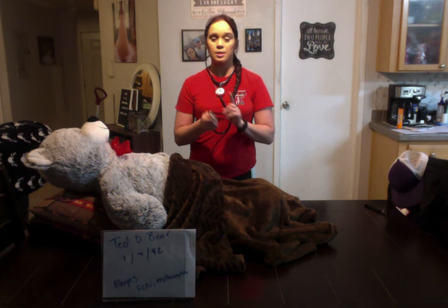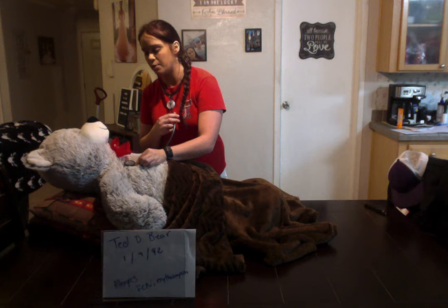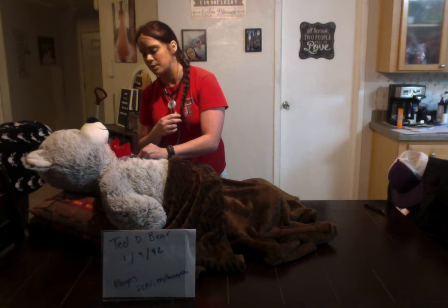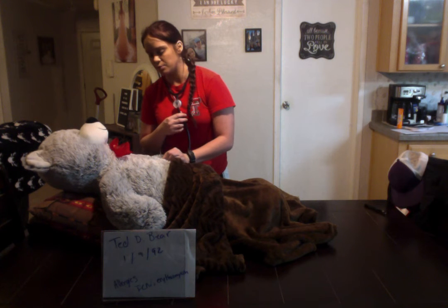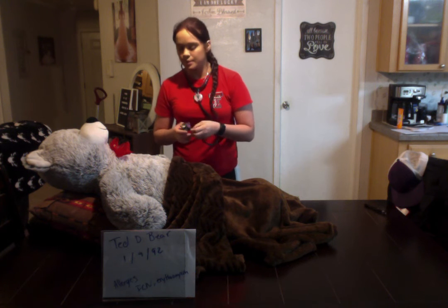So I'm going to turn it to the bell of my stethoscope, and I'm going to listen to the aortic, the pulmonic, the tricuspid, and the mitral. All right, so all of those sound really good.